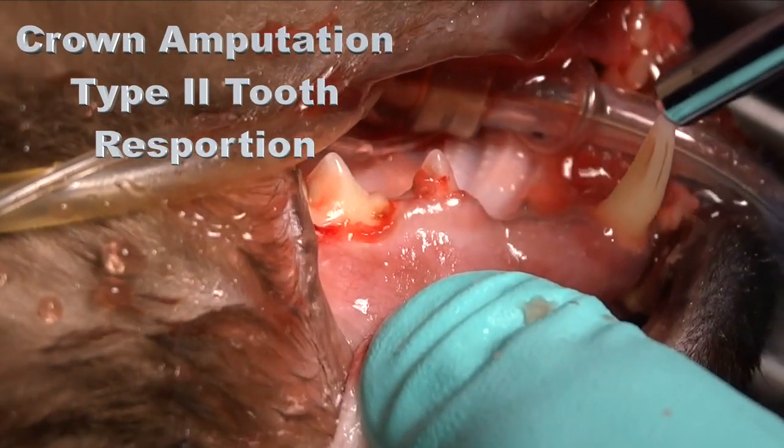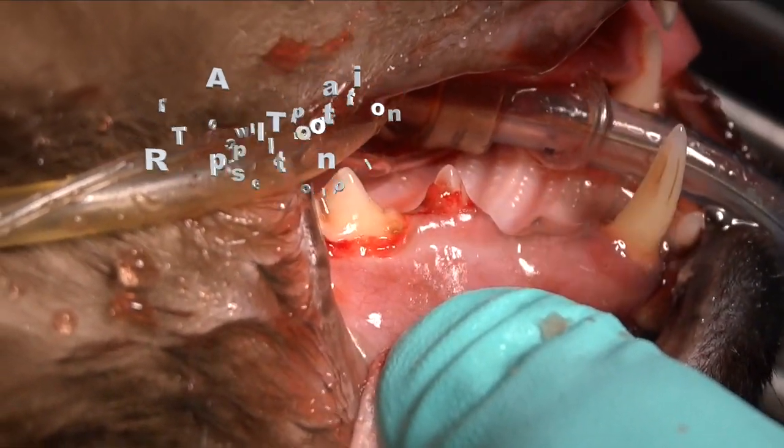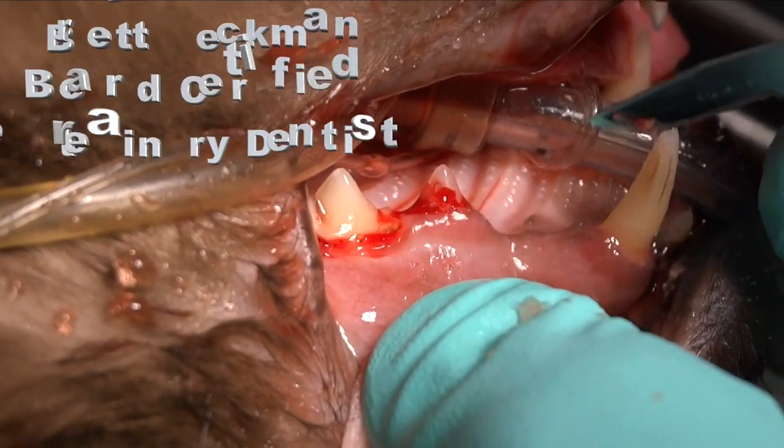In this video we're going to demonstrate treatment for type 2 tooth resorption in a cat. This cat is in dorsal recumbency.